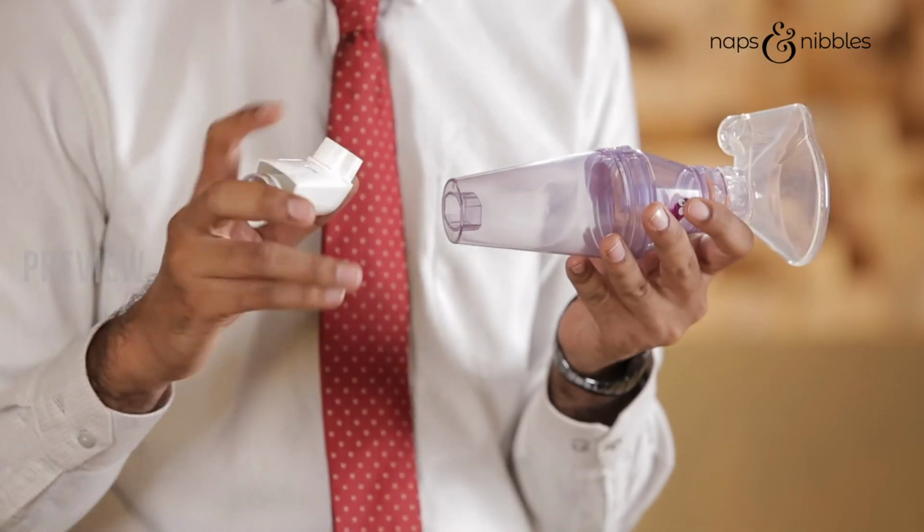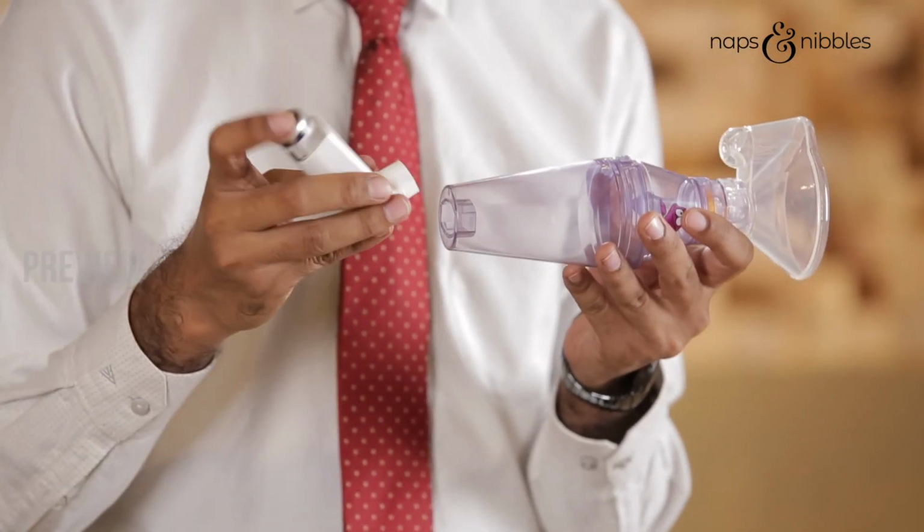In case you need to administer a second dose, then you need to again detach the inhaler, shake the inhaler well, reattach it, and follow all the exact steps again. Allow your child to inhale the second dose in the same way as we have demonstrated for the first dose. After finishing the dose, make sure that your child gargles with water to cleanse any medication left behind in the mouth. Remember that children should always use the spacer under parental guidance.